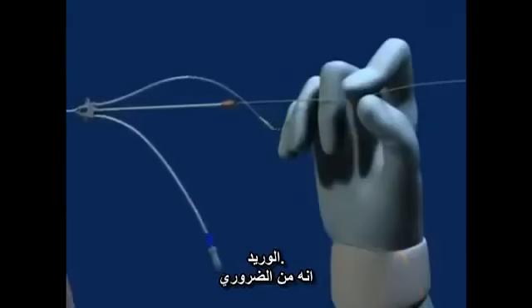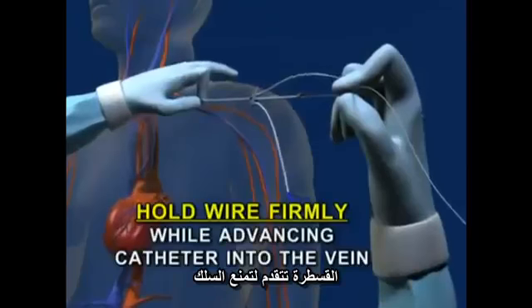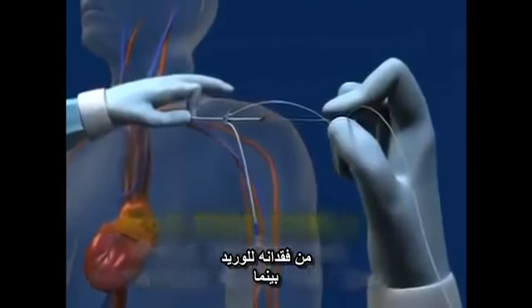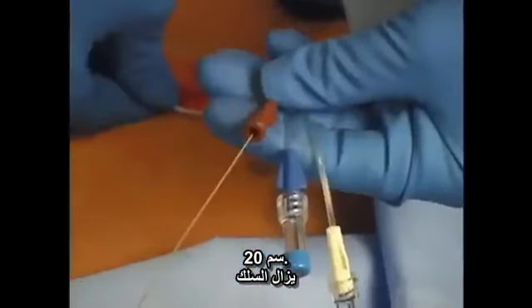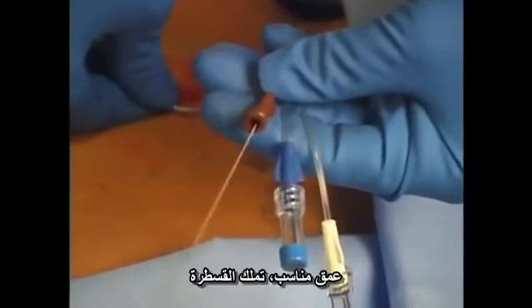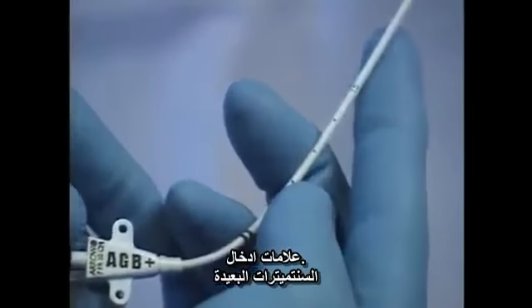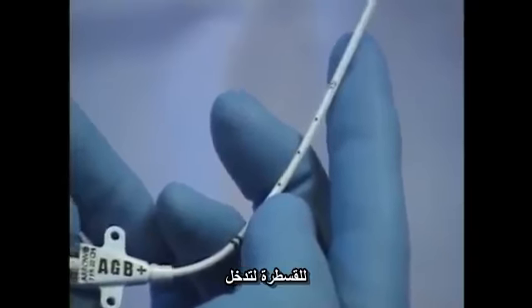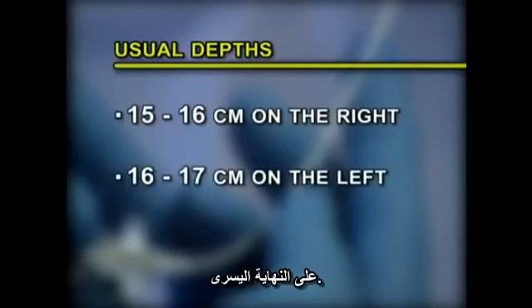It is absolutely necessary that the wire be held firmly while the catheter is advanced to prevent the wire from being lost in the vein. Once the catheter has been inserted to 20 centimeters, the wire is removed. The catheter can then be positioned at the appropriate depth. The catheter has markings indicating the centimeters of the catheter distal to the insertion site. Usual depths are 15 to 16 centimeters on the right and 16 to 17 centimeters on the left.